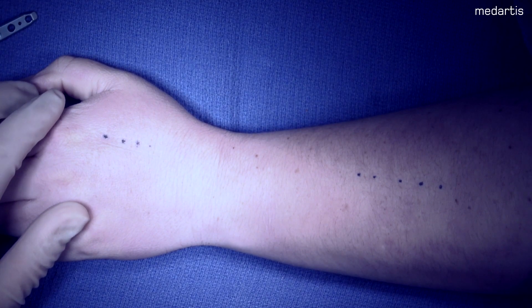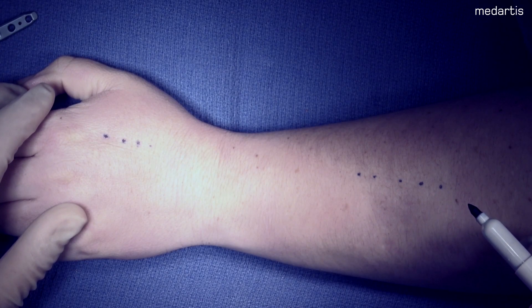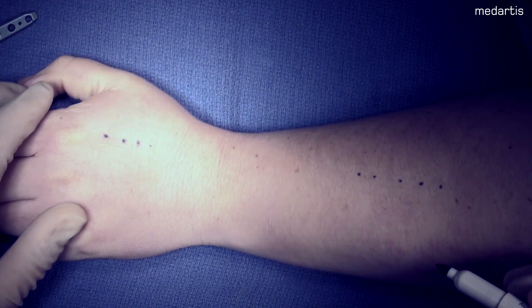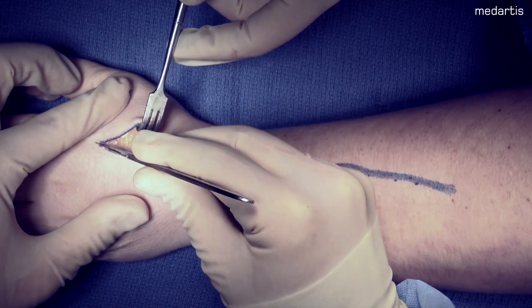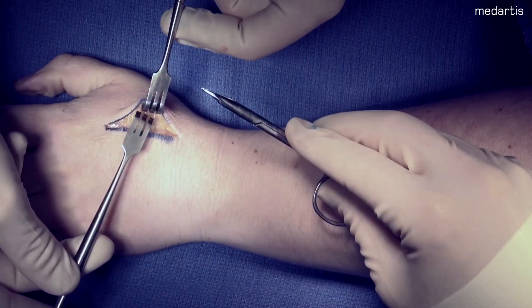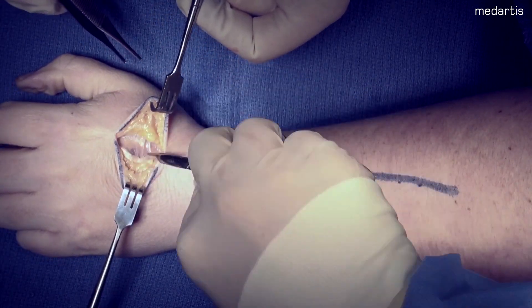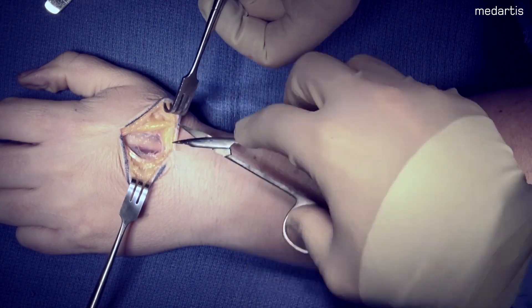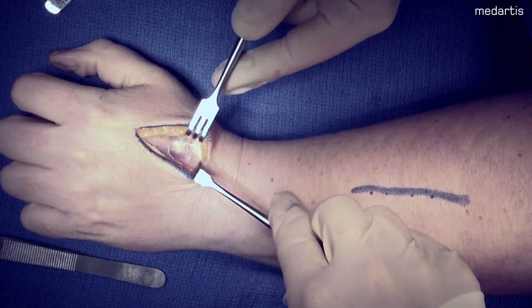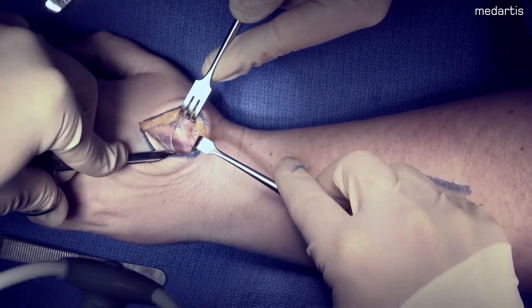Here you can see me marking out the incision using the plate as my guide. I want to make sure all four holes are just distal to the CMC on the metacarpal. Next I come proximally to mark out the appropriate position for our proximal incision. The first incision I make is over the second metacarpal. Here you have to be cautious of the superficial branches of the radial nerve and protect them. Then you can dissect down and be on the second metacarpal, trying not to disturb the dorsal interossei.